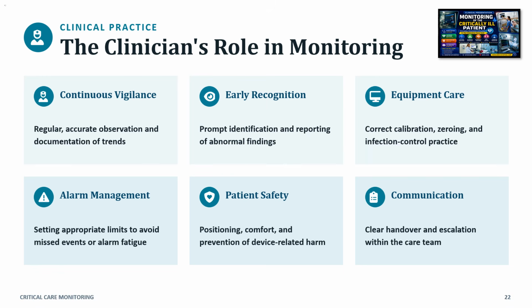Patient safety. Positioning, comfort, and prevention of device-related harm. This reduces pressure injury, dislodgement, and discomfort from monitoring devices and lines. Communication. Clear handover and escalation within the care team. This ensures continuity of care and prompt team response when a patient's condition changes.